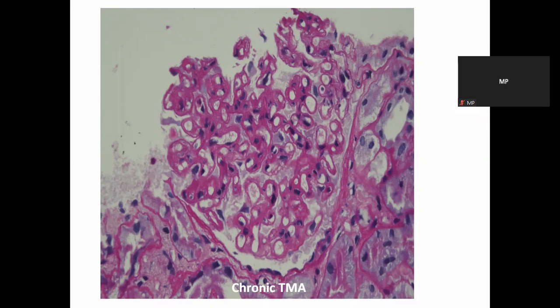There will be IgG 3 plus granular. There will be C3 which could be 1 plus or trace, and in a primary membranous, kappa and lambda will show equal staining, granularity. But in chronic thrombotic microangiopathy, since it is not an immune complex kind of thing, immunoglobulins will be negative except IgM. You have to remember one important point.